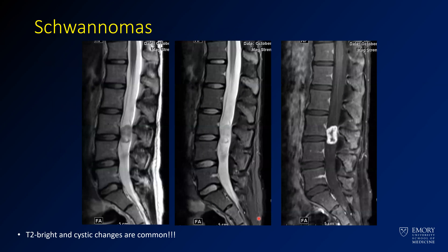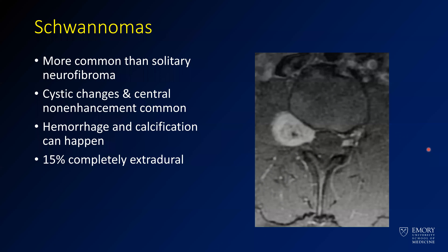Here's an example of a schwannoma — an intradural extramedullary lesion. All lumbar lesions below the conus are extramedullary by definition, since there's no spinal cord down there. Here you see a well-defined lesion in the thecal sac at L3-L4 with avid enhancement and a little cystic component — a very common location and appearance for a schwannoma. Solitary schwannomas are more common than neurofibromas. They tend to have enhancement and some cystic changes in the center; hemorrhage and calcification can happen but are less common.